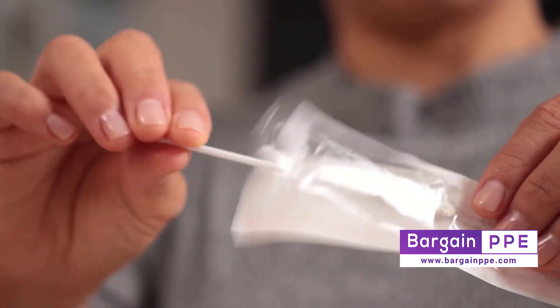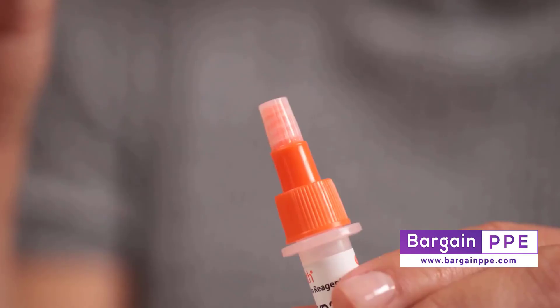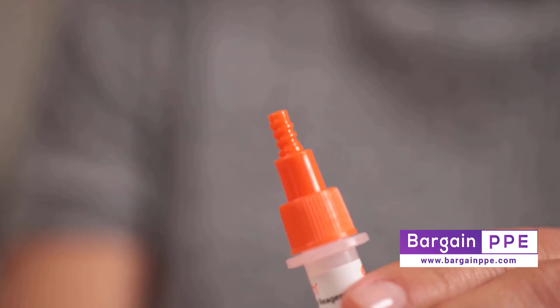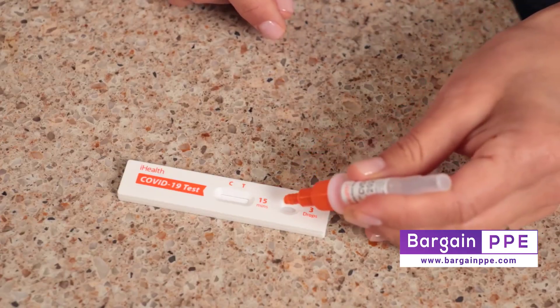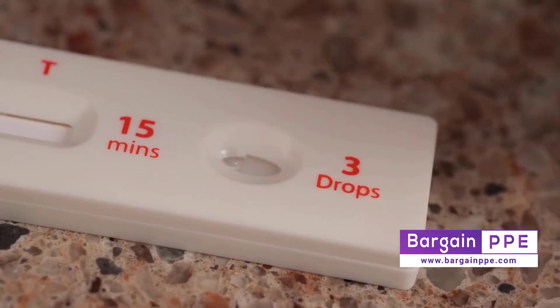You can now say goodbye to that swab. Now, let's test the sample. Remove the small dropper lid at the tip of your test tube and carefully squeeze three drops of solution into the receiving port on the test card.